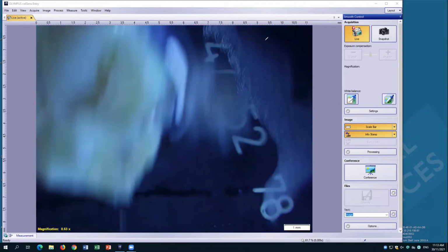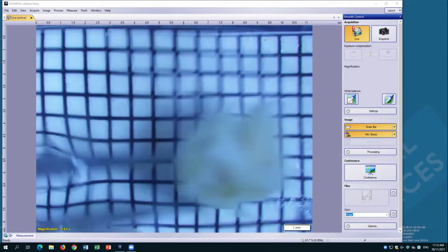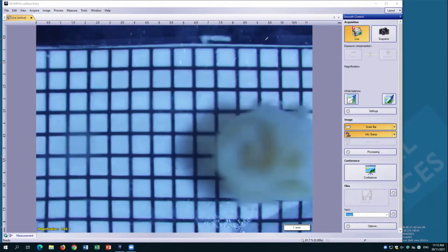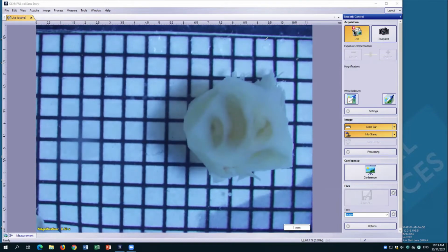Okay, so that's the standard preparation. Now for micro CT, what happens is that essentially what's close to what we've got, like this human tissue sample here, gets scanned for micro CT. And for micro CT's purposes, to get a good image, it's all about penetration and how to maximize the penetration of X-ray, but also how to change the absorption of X-ray by the different locations of the cochlea.